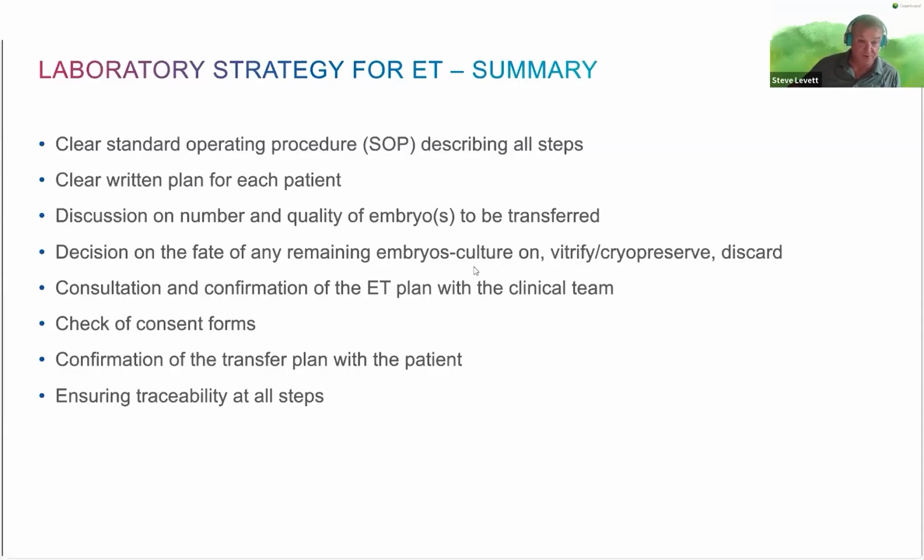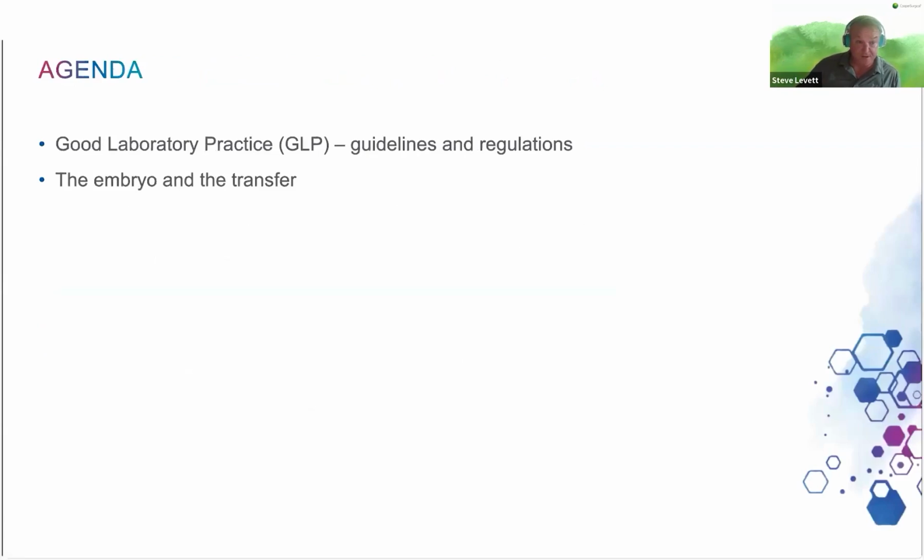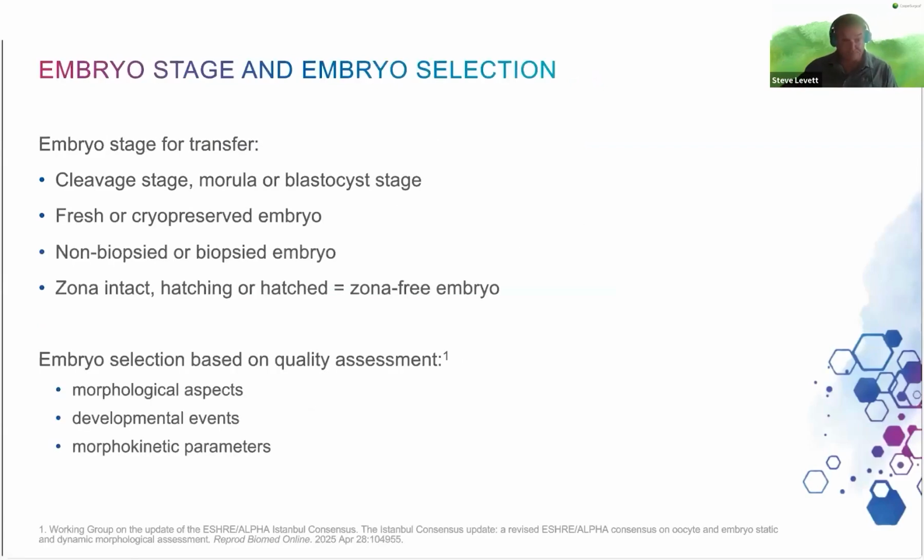And of course, we should have had a plan to discuss with the clinical team exactly what's going to happen. In those countries where it's appropriate, consent forms need to be filled in. And of course, we confirm everything with the patient, but nothing that we discuss at the time of embryo transfer in the operating room should be new to the patient. It's only confirming what we've discussed before. And again, just to reiterate, traceability at all steps during this procedure.